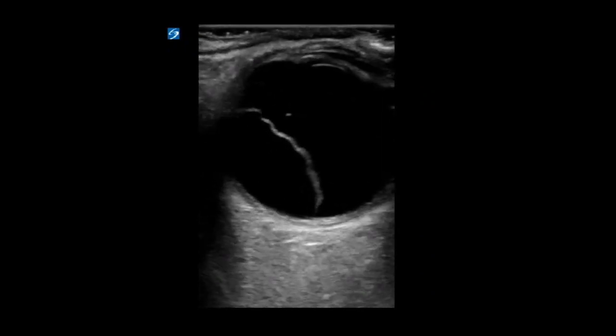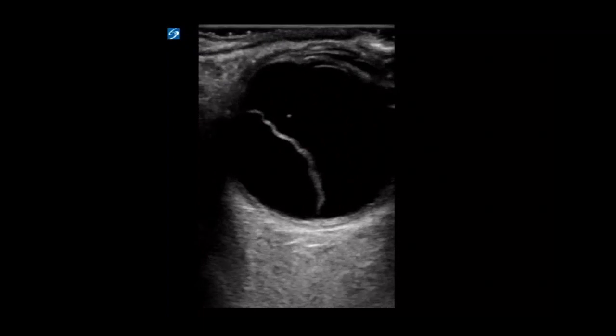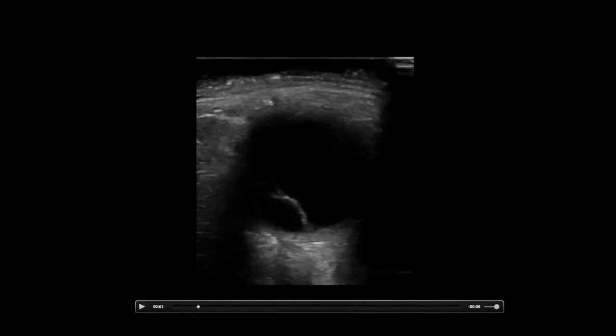And again, this looks like the first one. This is just showing that the pattern is pretty similar for a lot of people with a retinal detachment. This is again another retinal detachment. Here's an example of the retina attaching to the optic disc. If I pause the video here, you can clearly see it coming down to the optic disc. This is a good way of proving to you that this is going to be a retinal detachment.